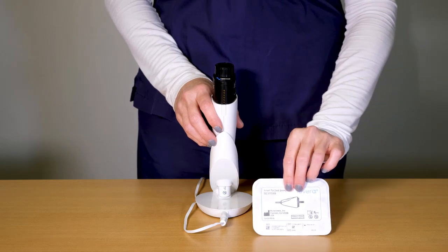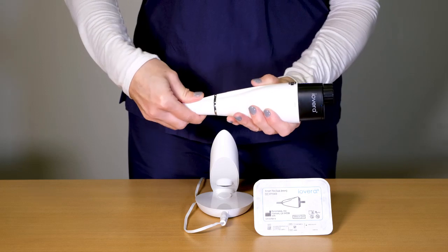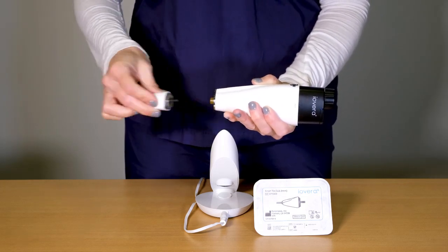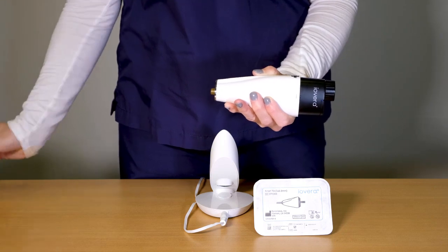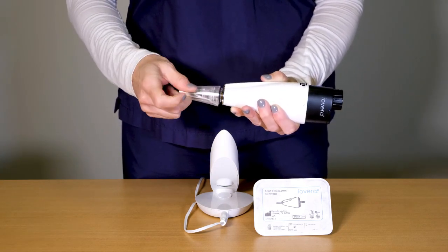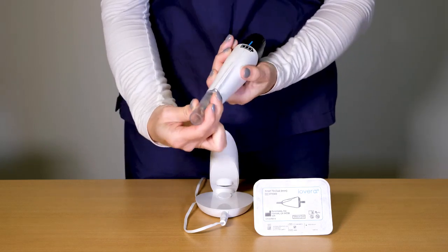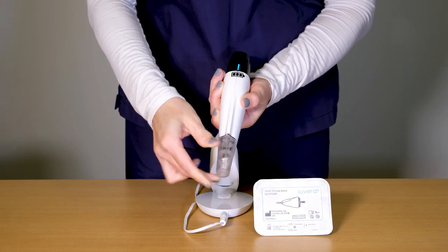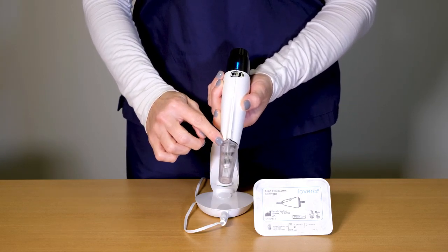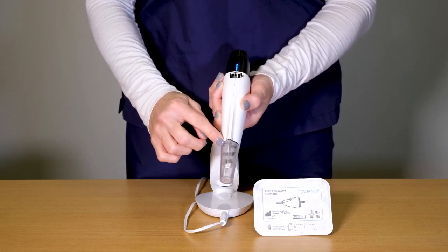Once priming is completed, it is time to attach the smart tip. Remove the storage tip by rotating it counter-clockwise. Attach the smart tip by rotating clockwise until the bevel is aligned. Alignment is confirmed by an audible beep. Over-tightening the tip may cause permanent damage to the handpiece.